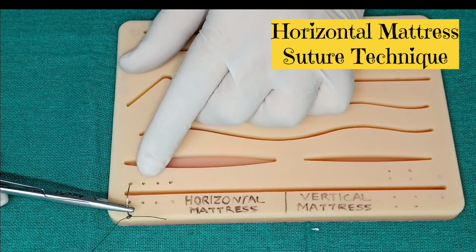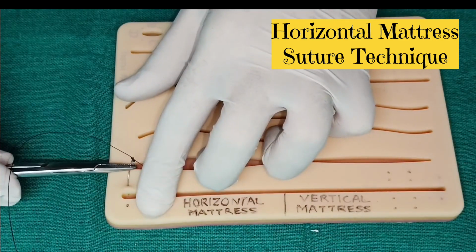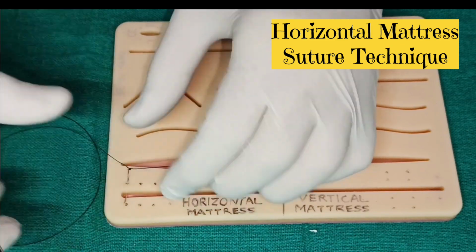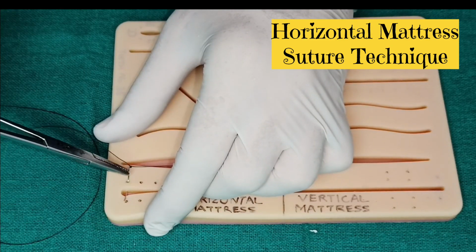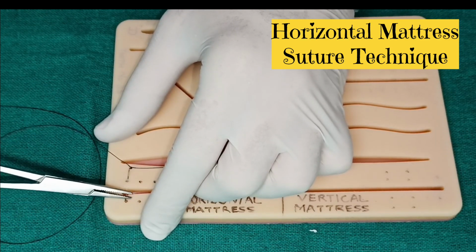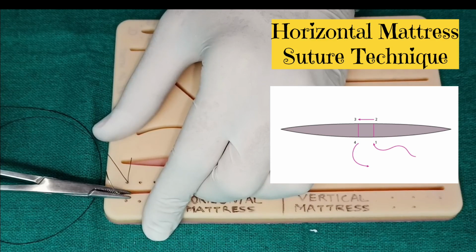First, we will understand the technique of horizontal mattress technique. So, place the first pass of the needle as you would a simple interrupted suture, but insert the needle into the skin a bit farther from the wound edge.